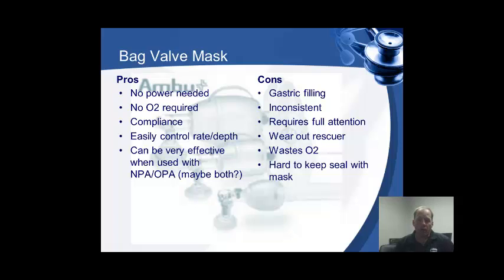What's wrong with it? Well, it can be inconsistent if you're inconsistent, or whoever's using it is, and it can fill up the stomach full of air. This can obviously cause problems with emesis and getting stuff in our airway that we don't want. It requires your full attention because you control the rate and the depth, so if you change, then it's changing the ventilations for your patient. You got to pay attention.